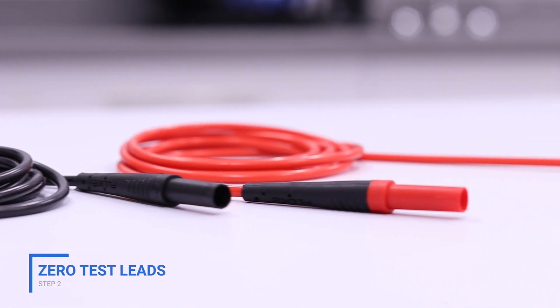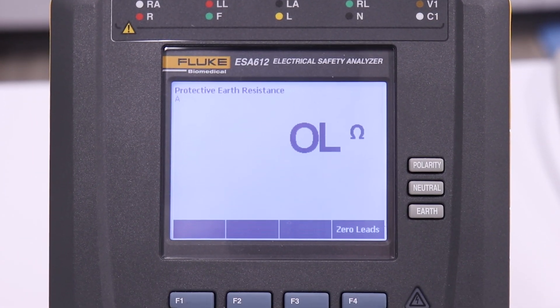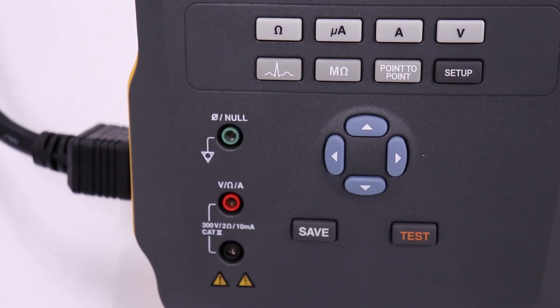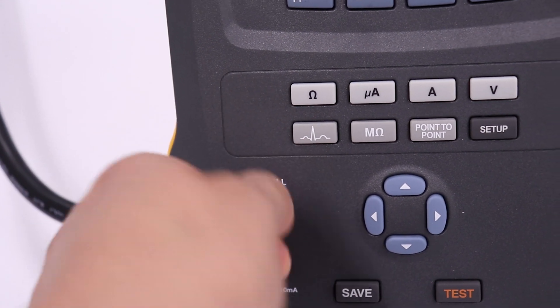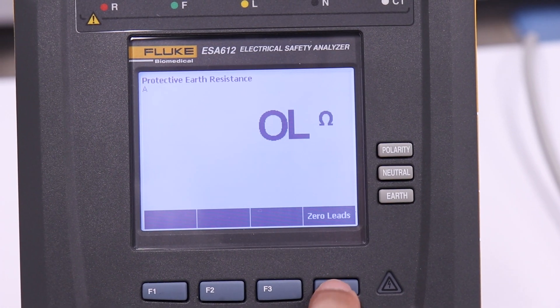We zero our test leads by pressing the Ohm button on the ESA. This will bring us to the protective earth resistance menu. Plug each end of the test lead into the volt ohm amp and ground null receptacles on the ESA. Press the F4 button to zero test leads.